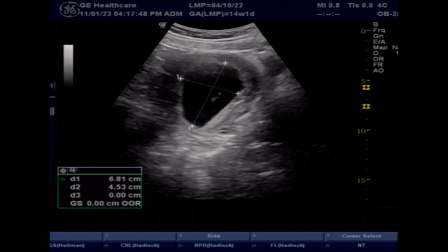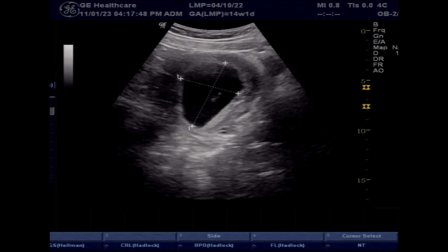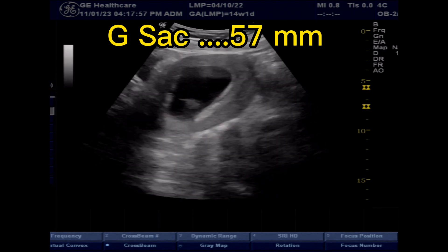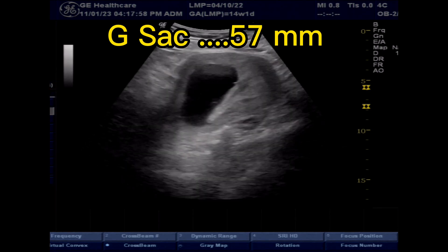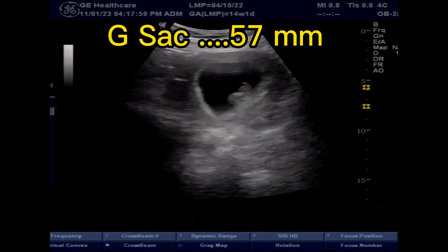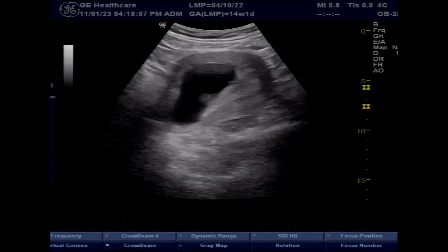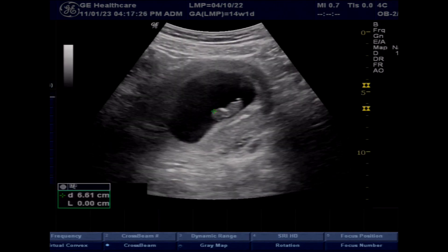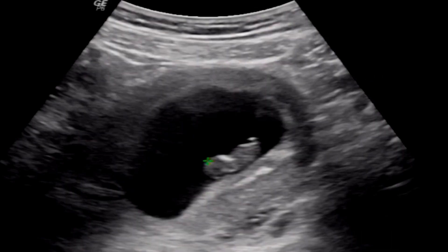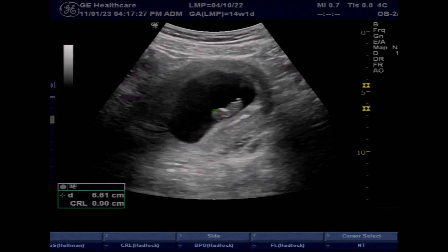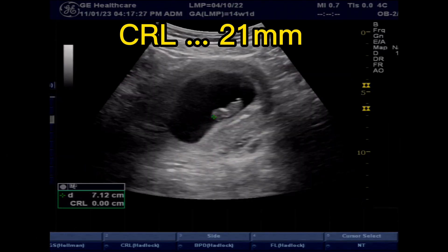But as a radiologist, never rely on LMP. The minimum time for fetal pole visualization is 5 weeks 4 days. Cardiac activity is positive as early as the fetal pole is seen. It is also positive on color Doppler.